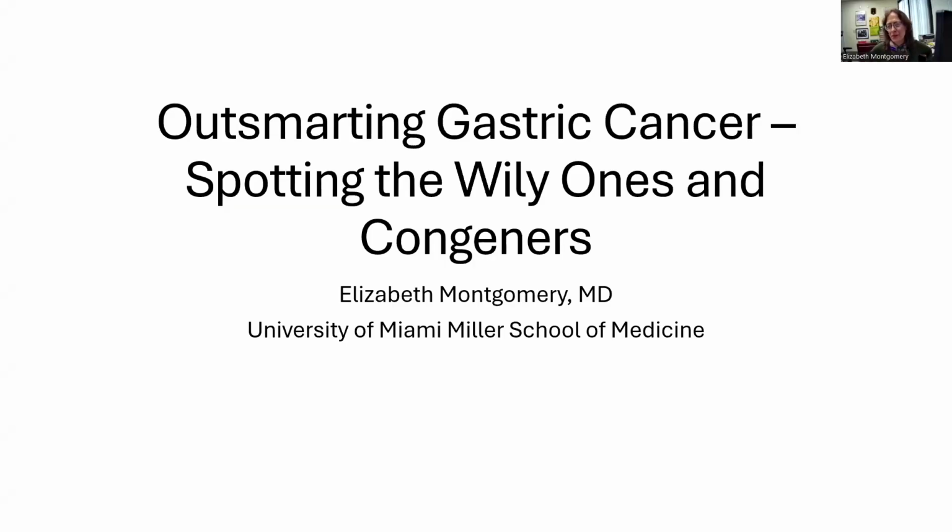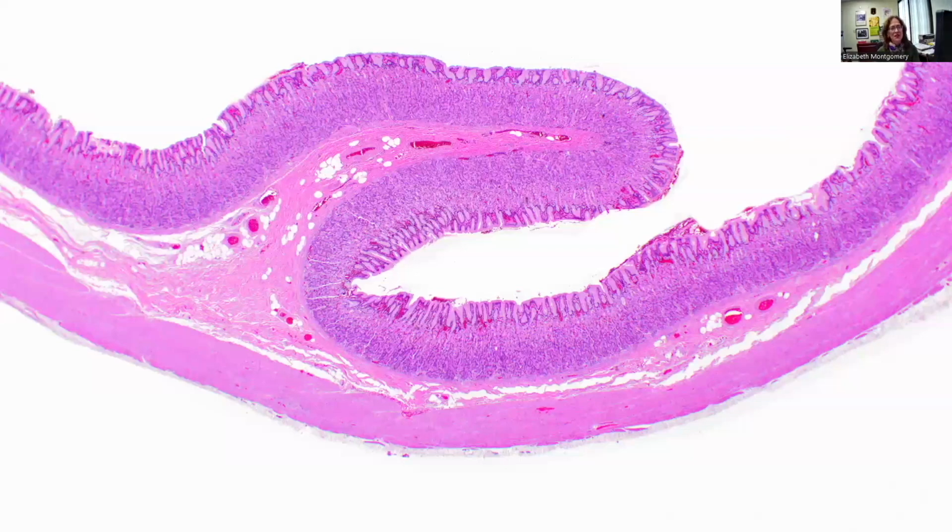And let's get started. All right, so we'll talk a bit about gastric carcinoma, but I'm also going to show pitfalls first. And just to remind ourselves, let's go back to the basics as we have several times.